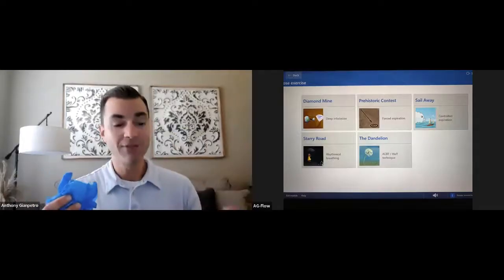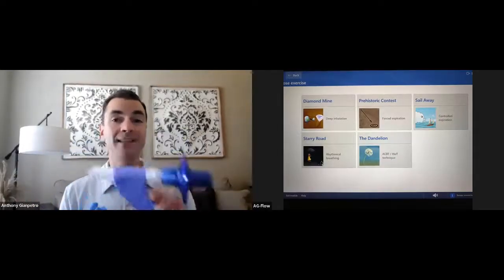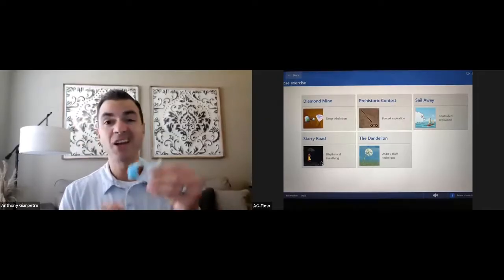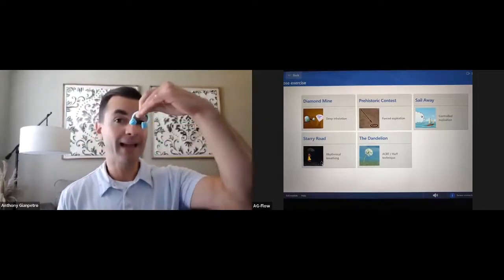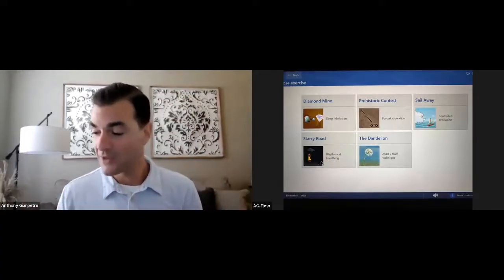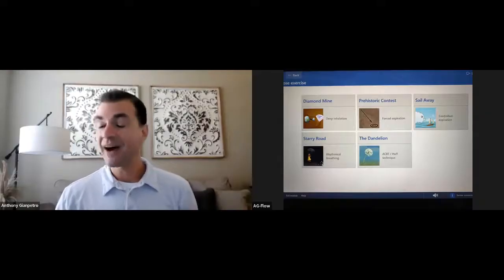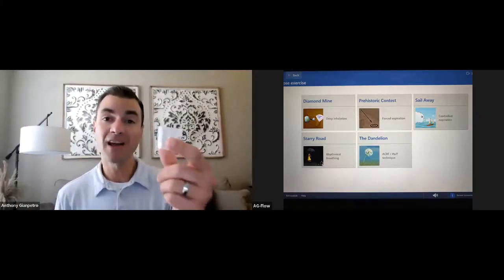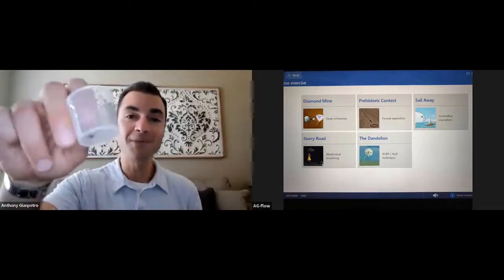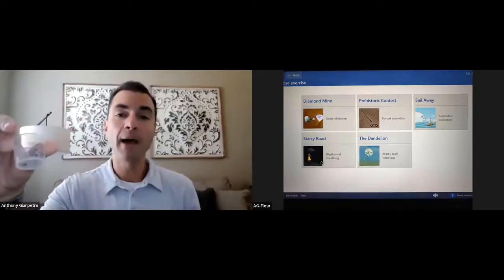When you're using the breathing device, even when it's in an enclosed system like this, you can have some particulates that you encounter. Some patients are going to need a nose plug, meaning like on top, to be consistent with what you're asking them to do so they don't cheat. So keep that in mind, have that handy. And then finally, having some type of collection cup. I'm a big fan of what I call the Robitussin cups, the cough syrup cups. They usually have mLs figured out.